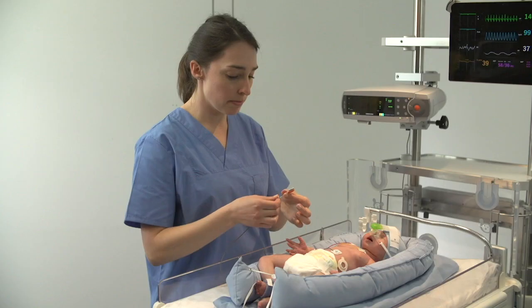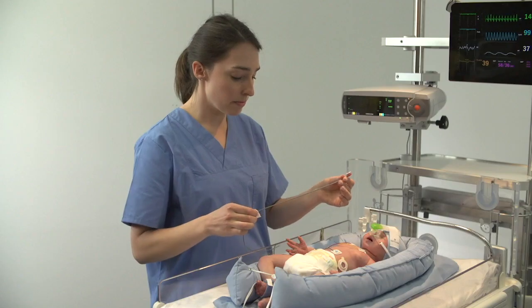Finally, carefully wipe the sensor cable. Do not pull or apply unnecessary force on the cable.